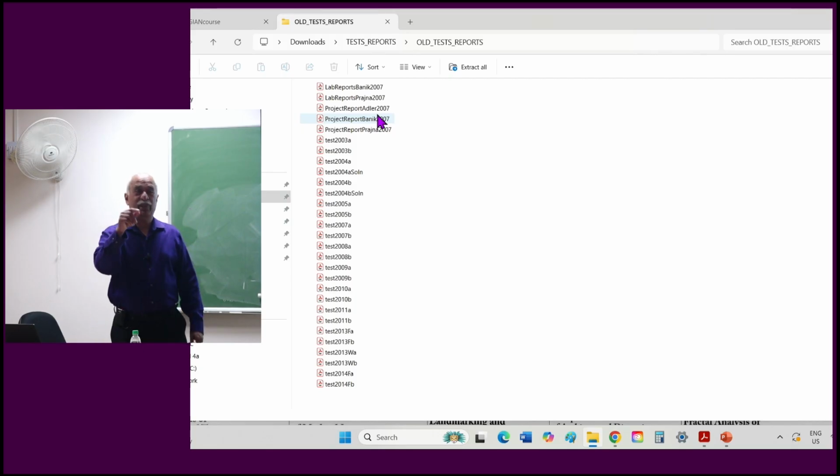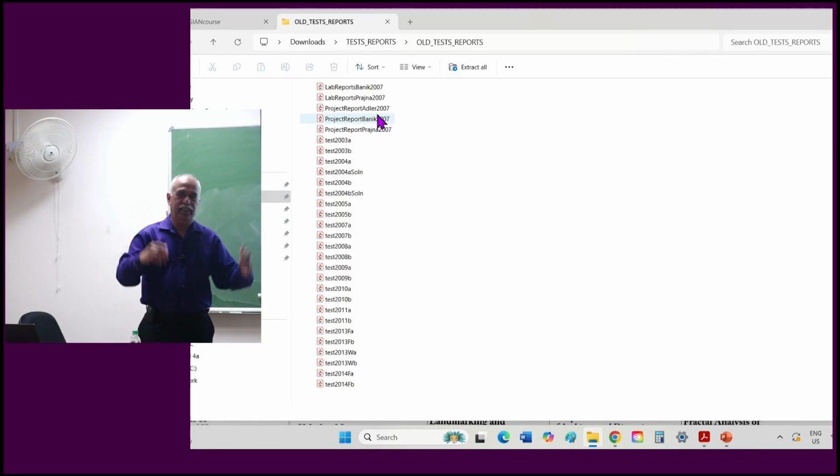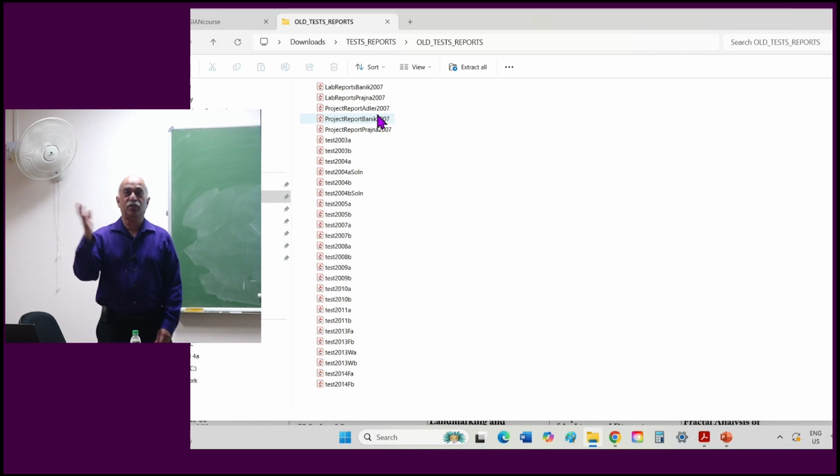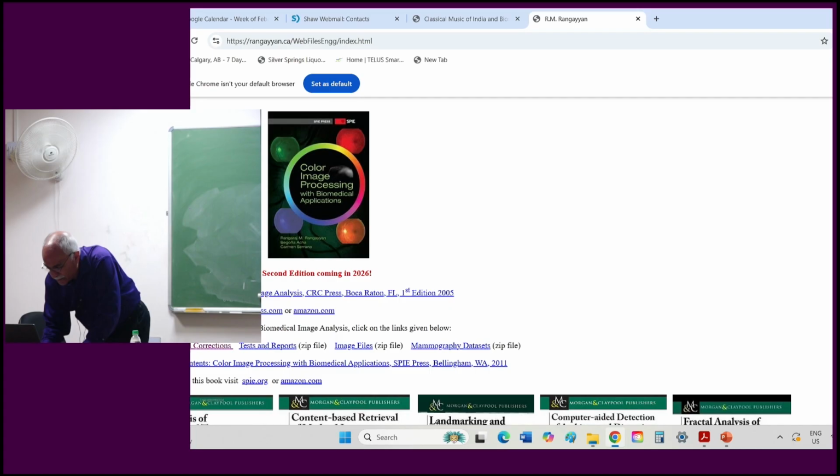The contours drawn by the radiologist are what I have. If you want to do shape analysis, just the contours, because there's nothing related to the patient and they're just contours. Those are available, and I don't know what else I've put in there. There are some pictures also if you go to that same updates and corrections, mammography data sets.